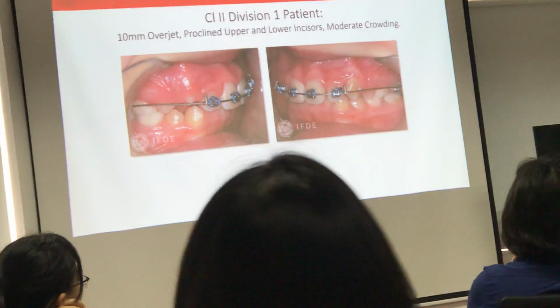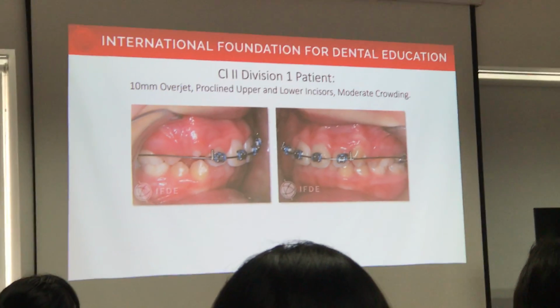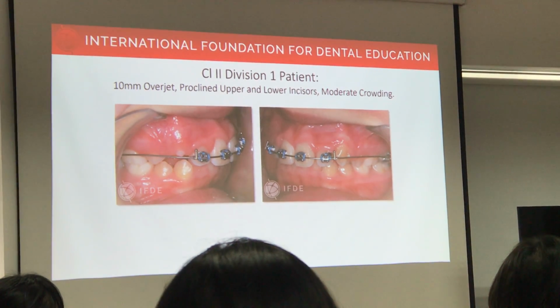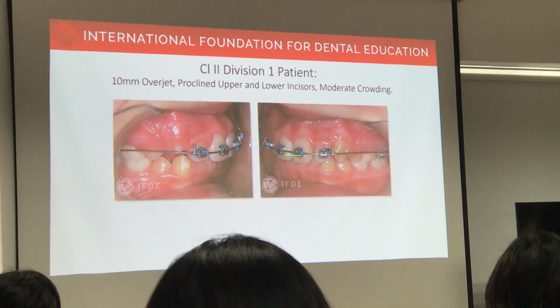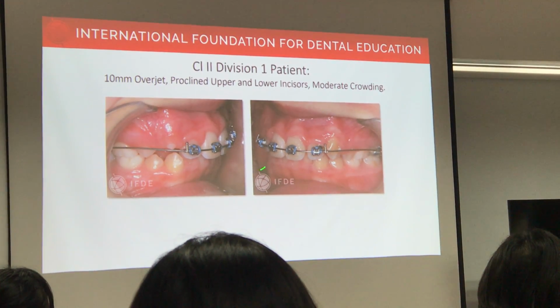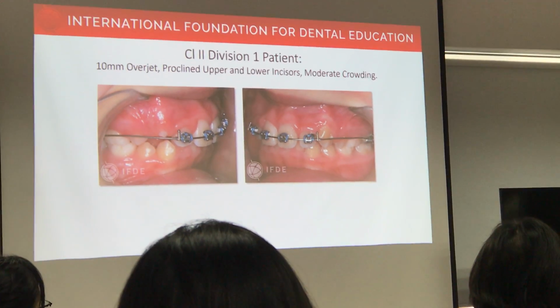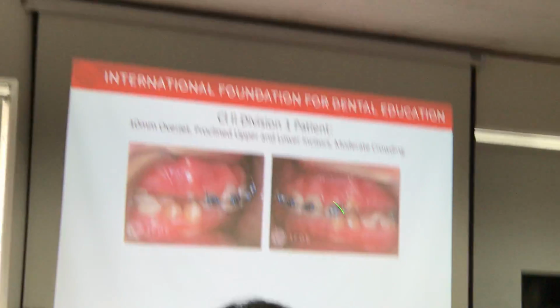Thì ở trường của tôi ấy, thì làm rất nhiều cái khí cụ này cho bạn trẻ con, nó gần như là 100%. Then because you're a very smart bunch of people, the 2x4 you're going to use, you may use one with a cut here with a little cantilever, depends on the inclination of the teeth. You don't have to use only this one. I showed you 3 or 4 different ones. In the same piece of wire, all you do is you change the design.